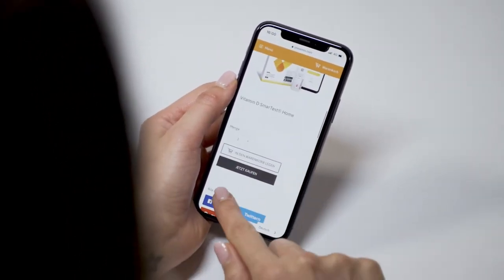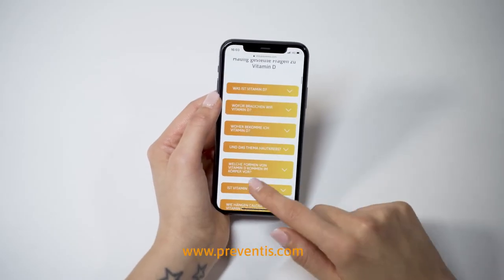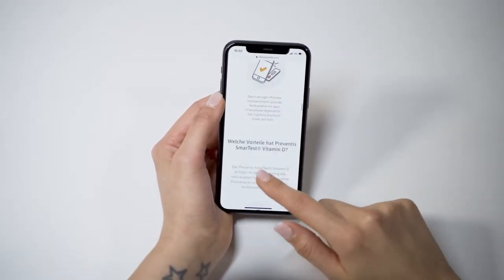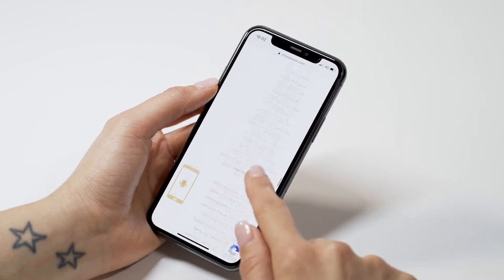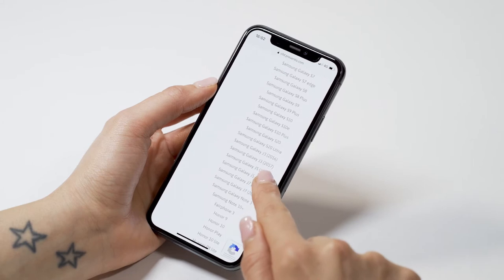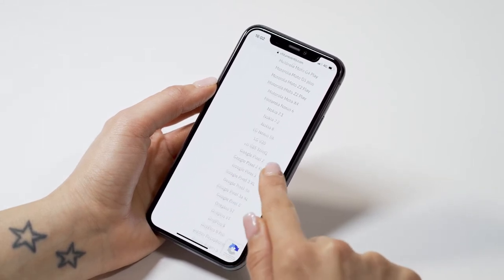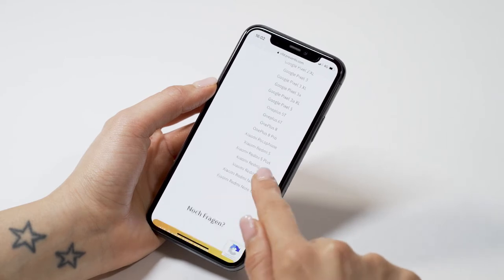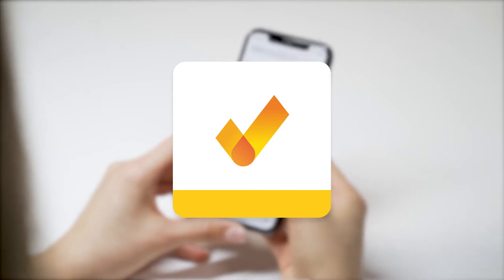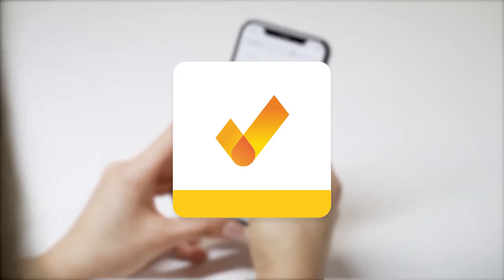Each pack contains accessories for exactly one test. Check our website www.preventis.com in the product description whether our app is supported by your smartphone. This is necessary because we test and approve each smartphone model individually — this is the only way we can ensure reliable test results. If your smartphone is supported, download the SmartTest vitamin D app from the App Store or Google Play Store.